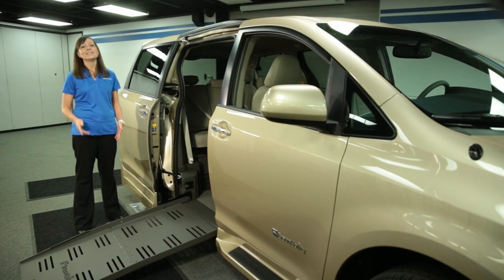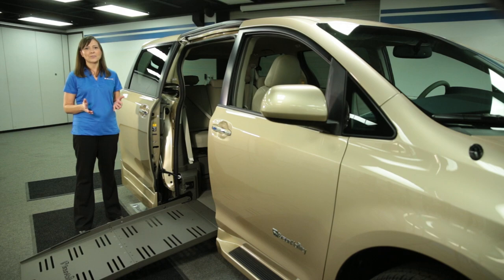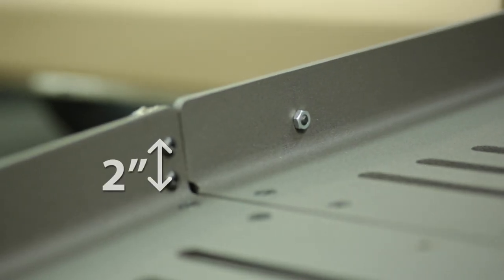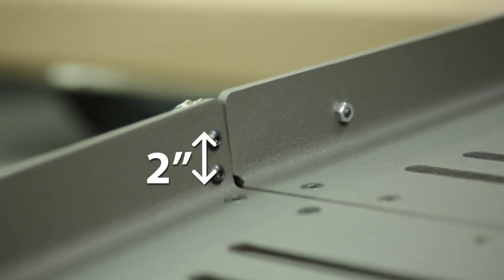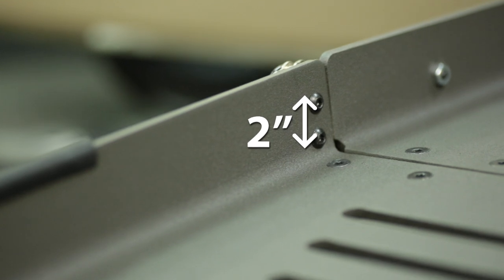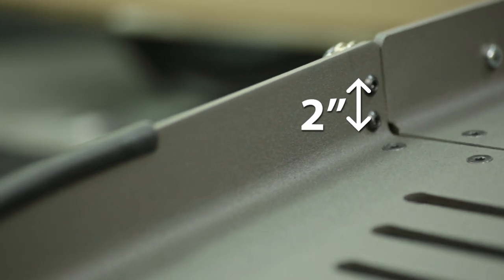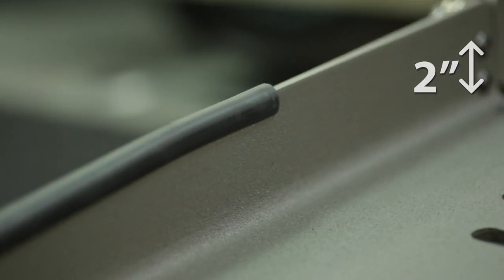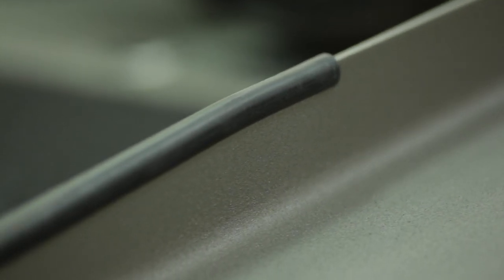Safety is always a top priority. The BraunAbility fold-out ramp comes with two-inch tall side rails to help ensure the wheelchair or scooter stay centered safely on the ramp.